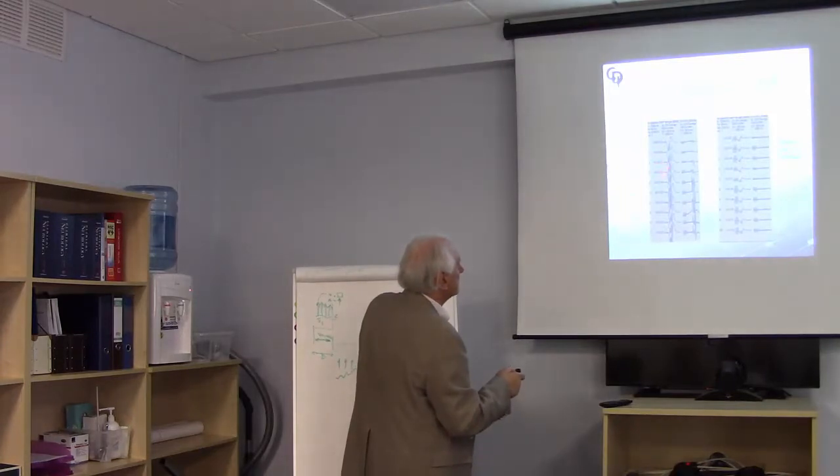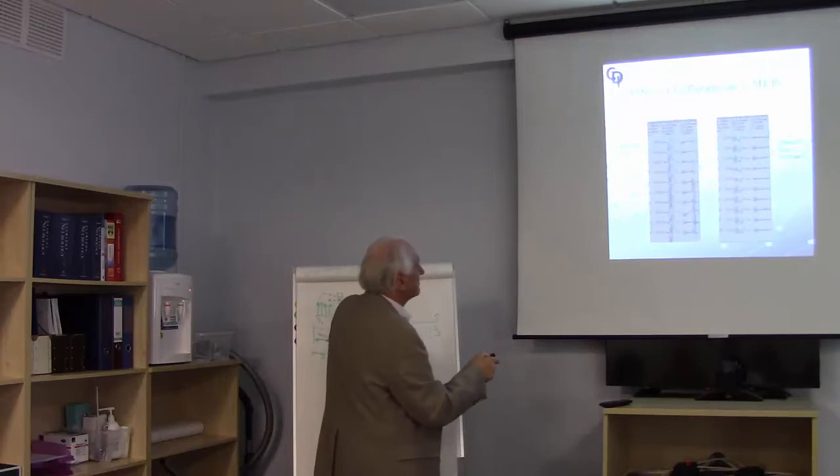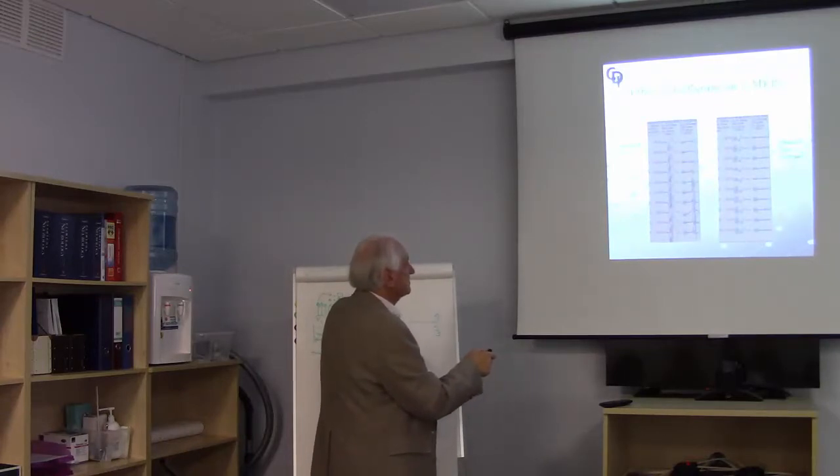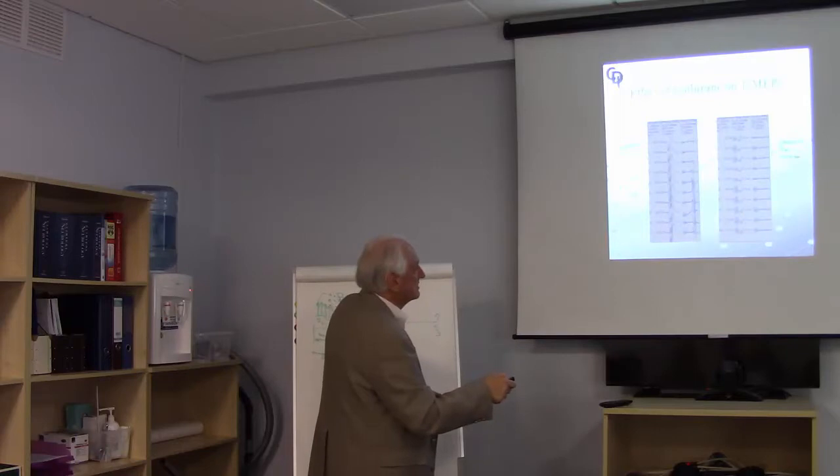21, 20. Actually, these are 2 seconds apart. 21, 23, 24, 1 to 2 seconds apart. And so at this point in the operation, the propofol was at 100, the REMI was at 0.4. So over here, they decided to decrease the propofol, decrease the REMI, and turn the ISO on up to 0.3.